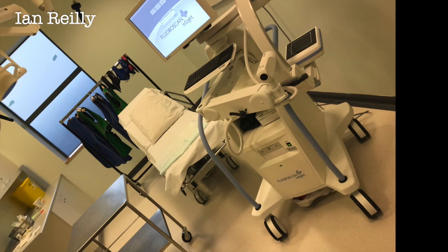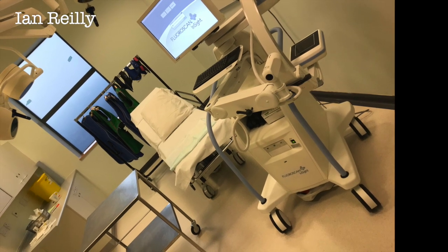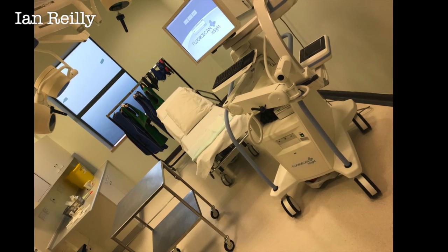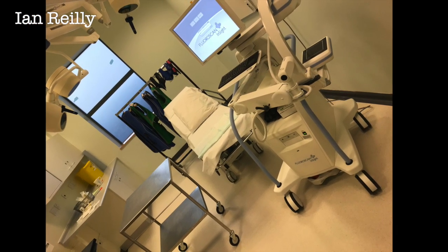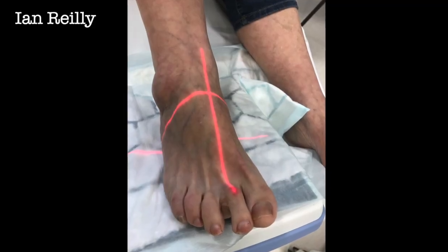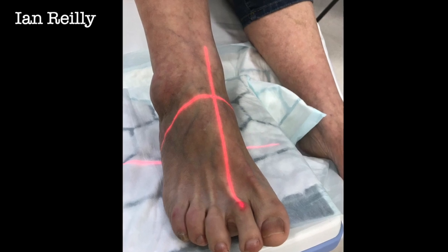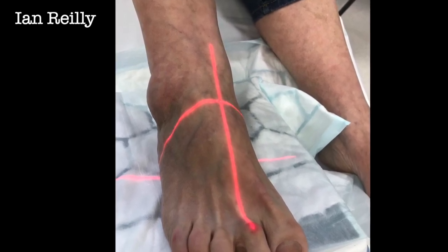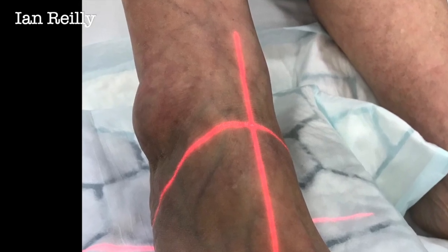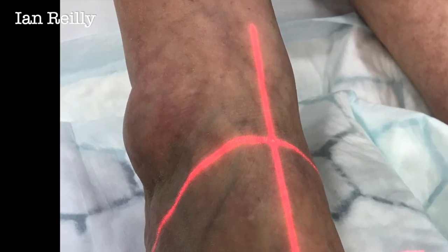It's known as Johnny Five to the team, if you remember the film Short Circuit. All the drugs and dressings are in the cupboard on the left, and at the back you can see some x-ray gowns — we obviously wear those anytime we've got x-rays out, including thyroid and eye protectors. We've got optional use of a laser cross on the x-ray machine just to help with needle placements. I didn't use it in the video but I did this just before I set the camera running, just to help locate the ankle joint before I started the injection technique.